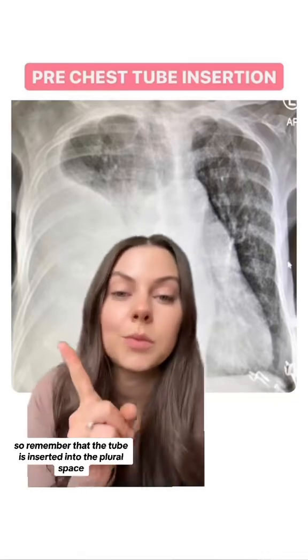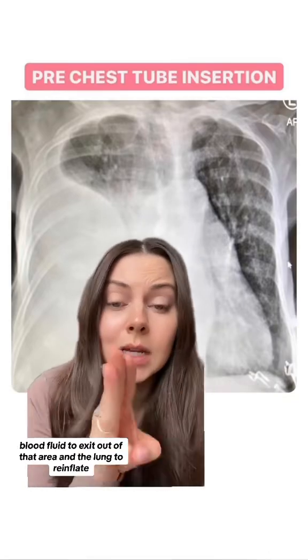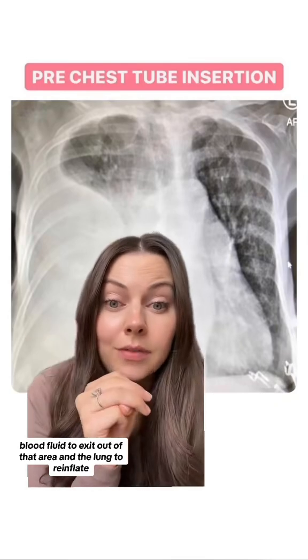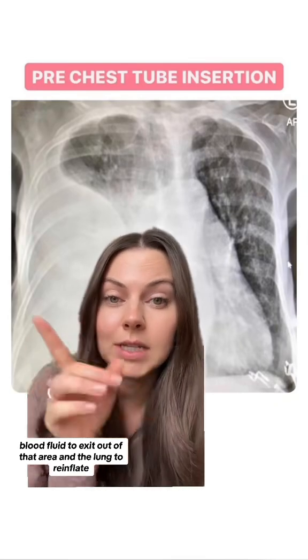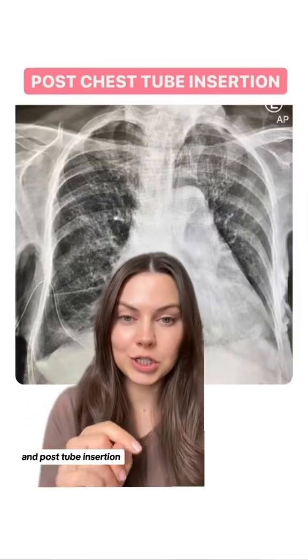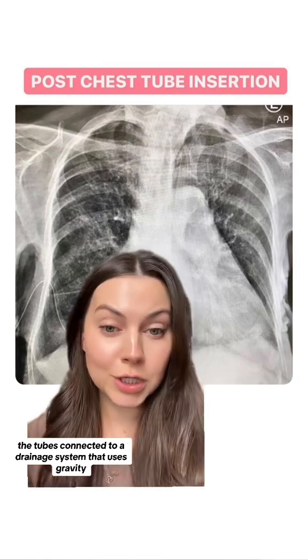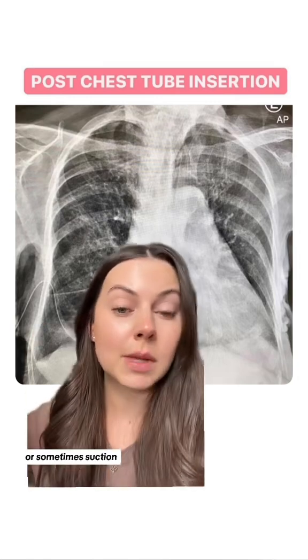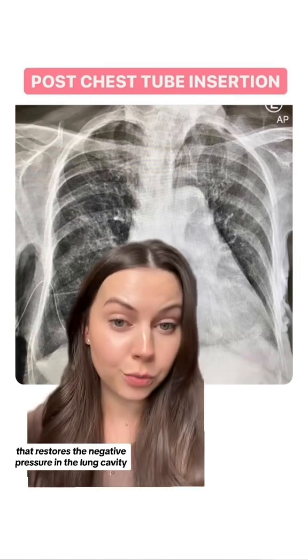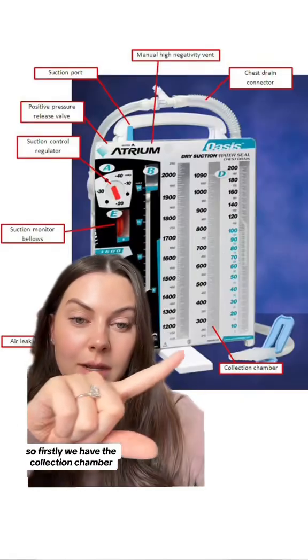So remember that the tube is inserted into the pleural space, so it allows air, blood, fluid to exit out of that area and the lung to reinflate. So this is pre-chest tube insertion, and post-tube insertion, you can see that the lung has reinflated. The tube's connected to a drainage system that uses gravity or sometimes suction that restores the negative pressure in the lung cavity. So firstly, we have the collection chamber.